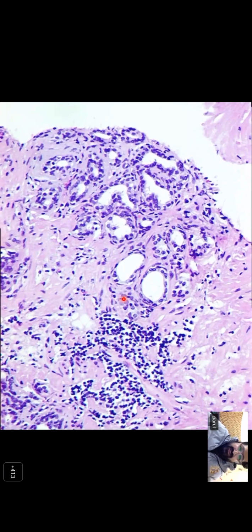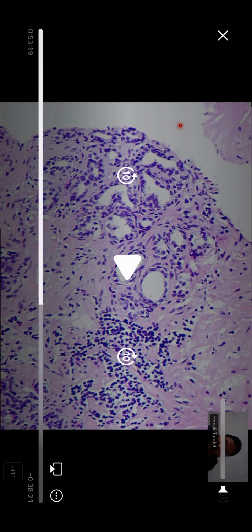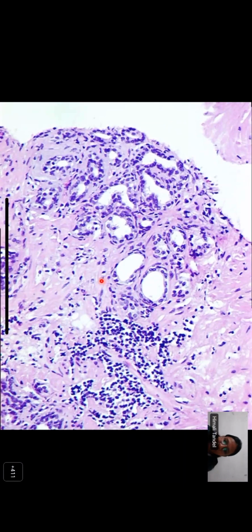Okay, it is definitely a tumor, not a benign condition, sir. Okay. Any difference of opinion? Himali, Poonam? No, sir. Sir, we are able to draw an imaginary circle around each of the glands. Very good. That is normal. But on the other slide, we can see some of the glands have got fused. I'm not able to draw that circle.